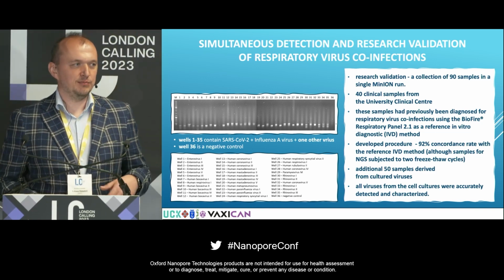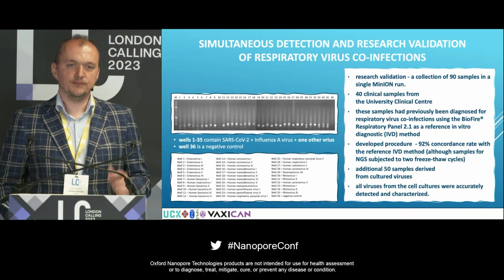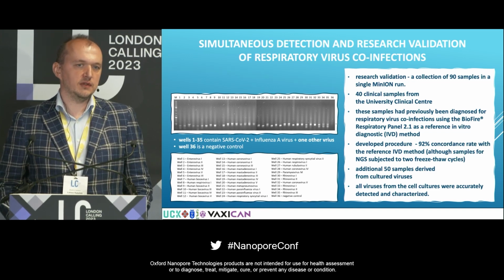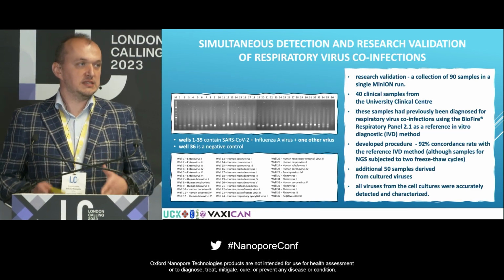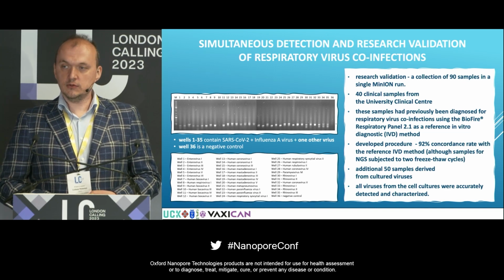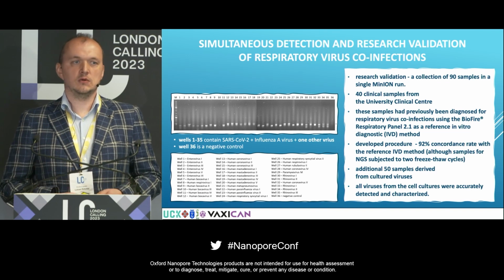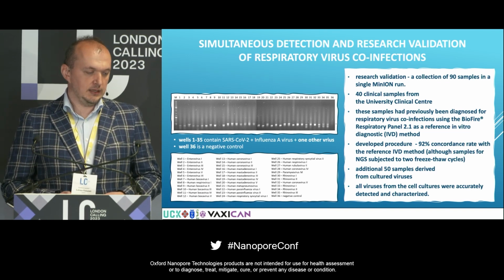The samples were not perfect, but we achieved about 92% of the same results as the IVD method. Because the samples were not good, some of them terrible, I think it's still nice. We also did validation on cultivated virus, about 50 samples with different mixes and matches, and we have a 100% hit. So we are quite happy with that.